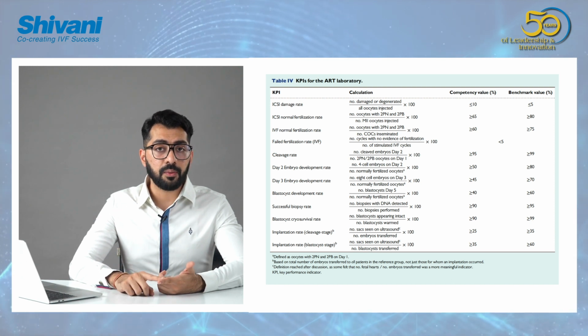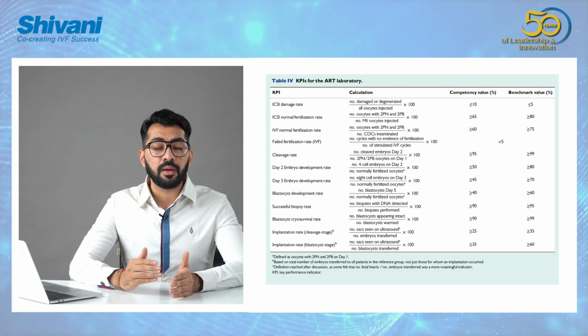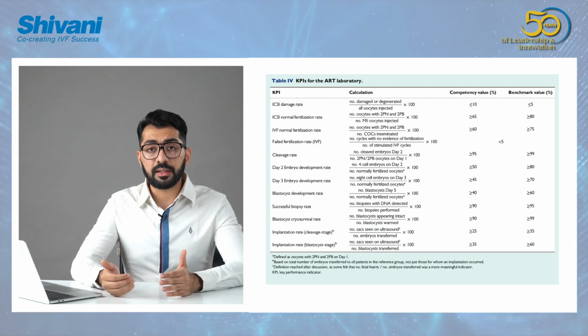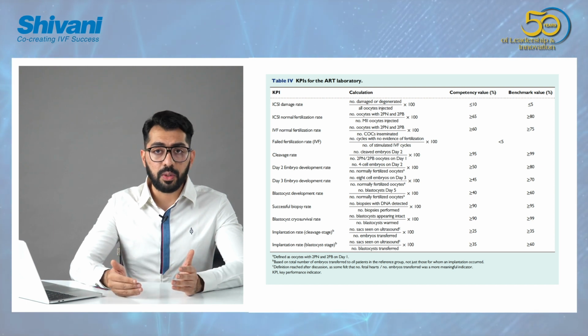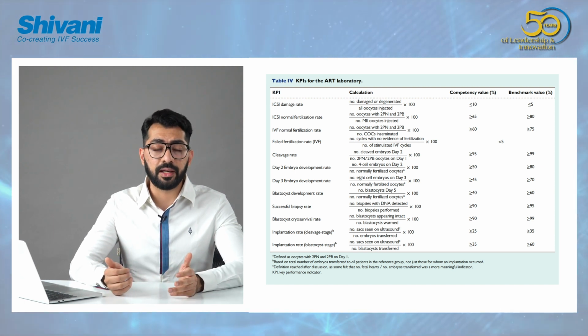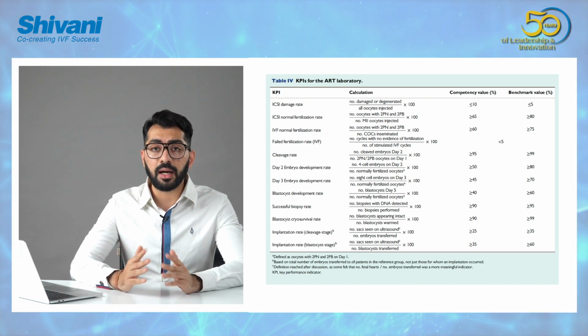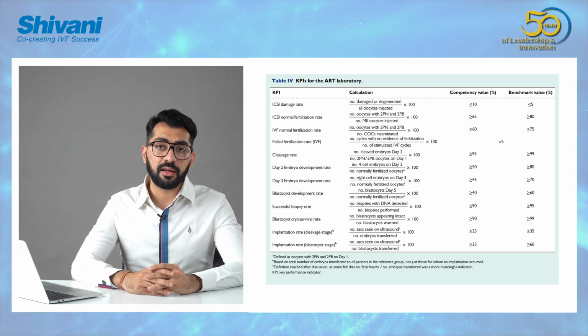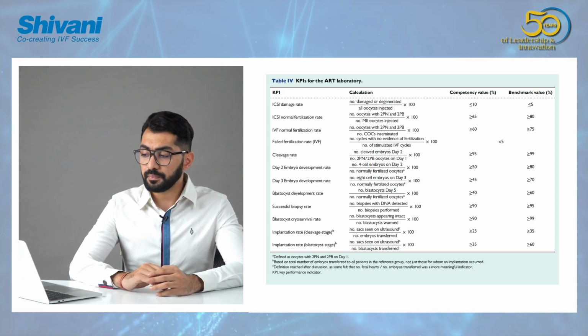The second thing that I want to assess here is, what are my culture conditions like? Is it because of the culture conditions that the embryos are not cleaving, or is there some fluctuation with temperature, pH, osmolality, etc. that the embryos are not cleaving? These are important cardinal factors that I want to assess if the cleavage rate goes below 95%.